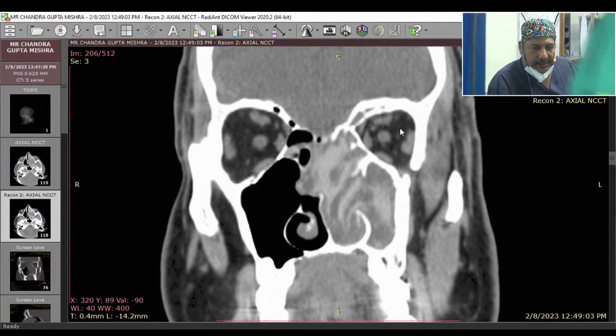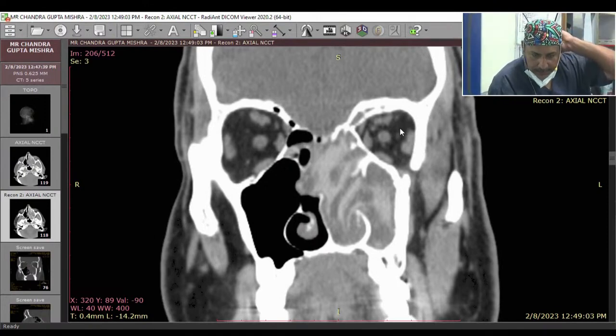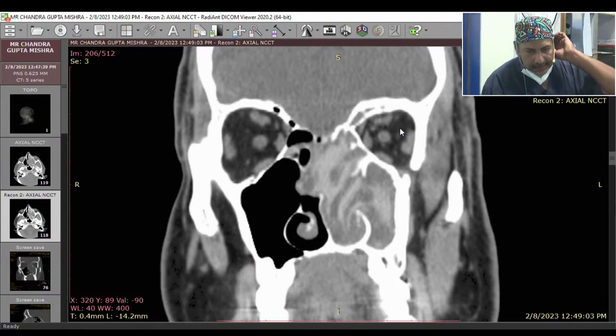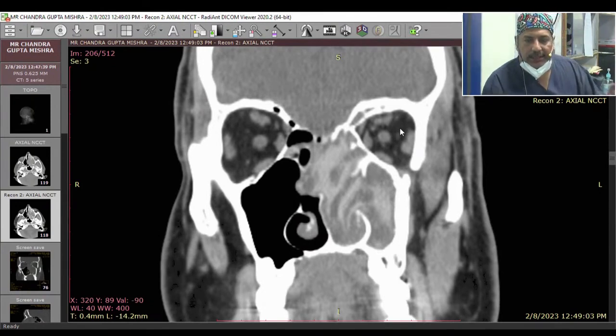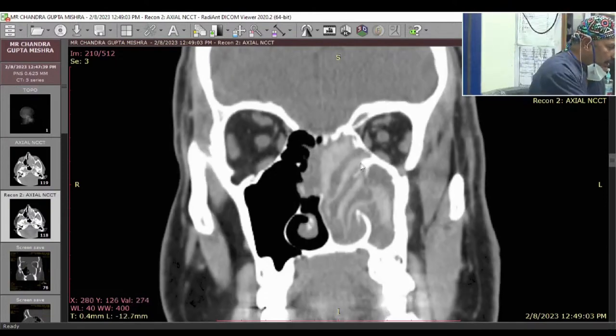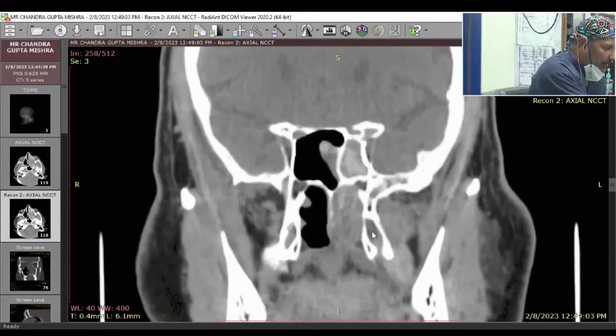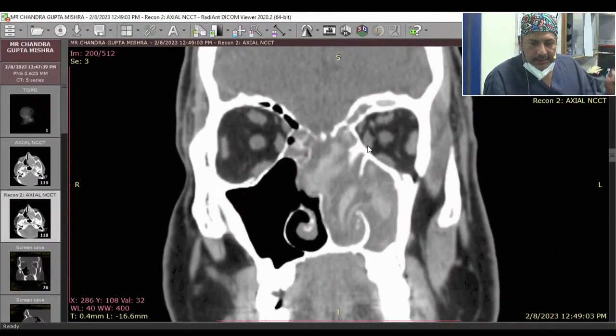Yes, sir. Heterogeneous hyperdensities, wide ballooning of the sinuses. Disease is trying to push the sinuses out towards the perisinus area, and this is how this kind of disease presents. See this fungal eosinophilic material which is presenting as hyper and hypodensities. I hope I am audible. Yes, sir. Audible, sir. So this patient has all the classical signs and symptoms of allergic fungal sinusitis. This is an endotype.